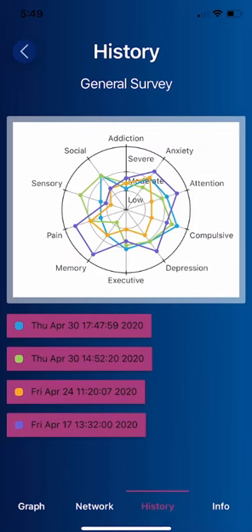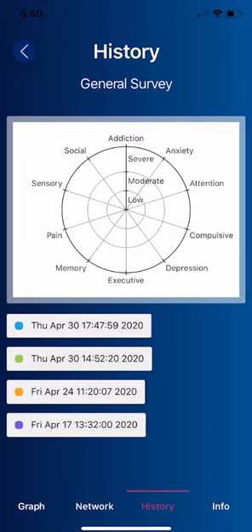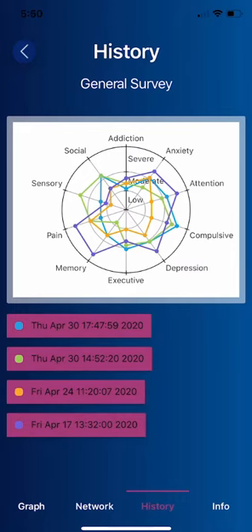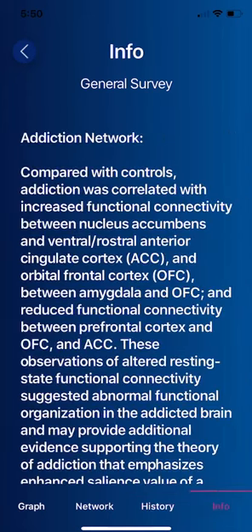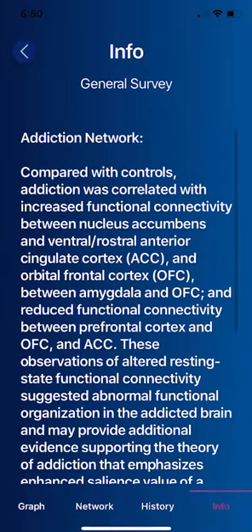We can then look at the history. If you take multiple tests over time, you can see how your symptom severity has changed. This information is valuable to a clinician and to the individual — whether they see a clinician or not — to see how various aspects of their mental health are moving towards the center of the radar map. For each of these networks, there's published science you can find via Google or PubMed in the National Library of Medicine.